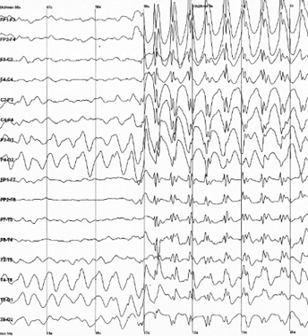Signal-to-noise ratio is poor, so sophisticated data analysis and relatively large numbers of subjects are needed to extract useful information from EEG. With other neuroimaging techniques.